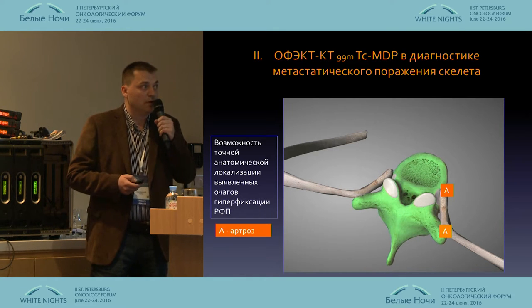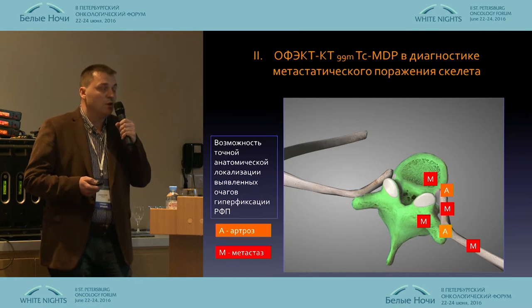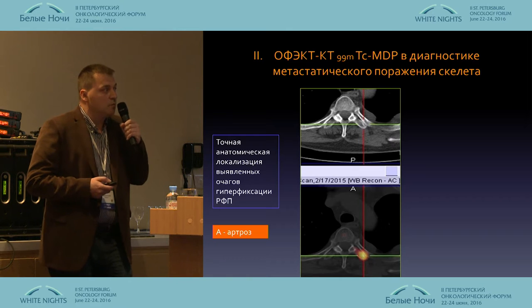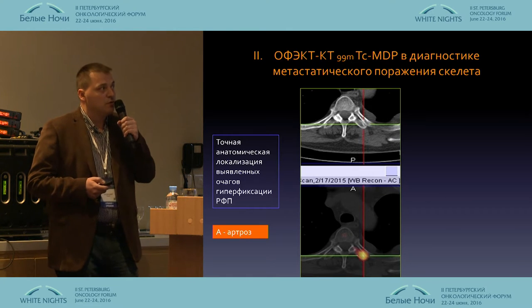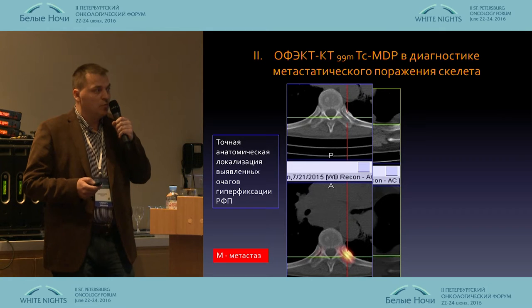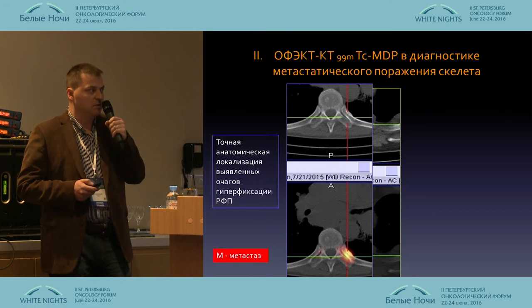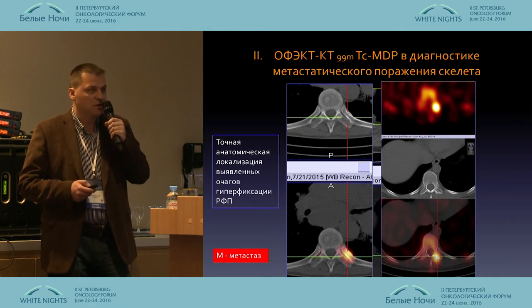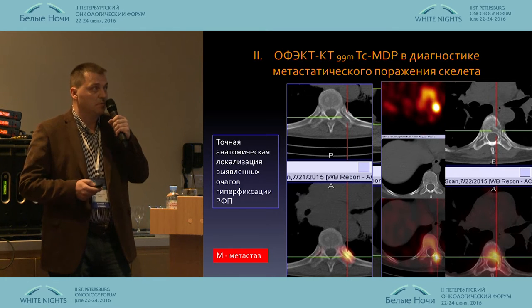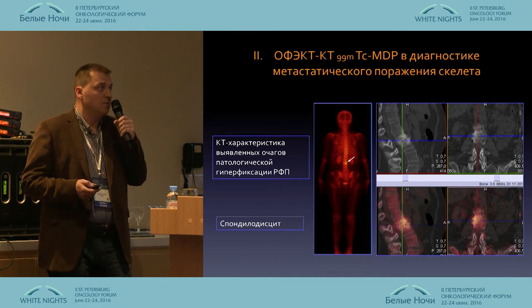For example, at the rib and spinal joint, the tubercle of the rib is where arthrosis develops, while the root and neck of the rib and the process is where we see metastasis. This is an example of arthrosis with subchondral sclerosis of articular surfaces and accumulation of tracer. And in another observation, accumulation of tracer in the neck of the rib indicates a metastatic lesion. Another example of metastatic lesion is lytic destruction of a transverse process, showing a classical lesion of the root of the arc — metastasis.